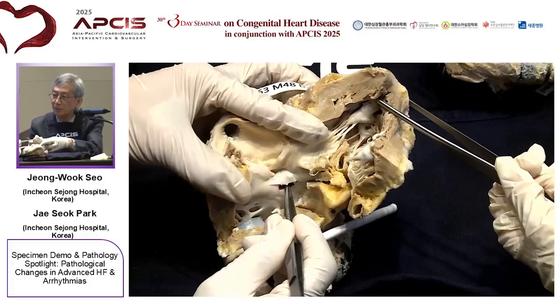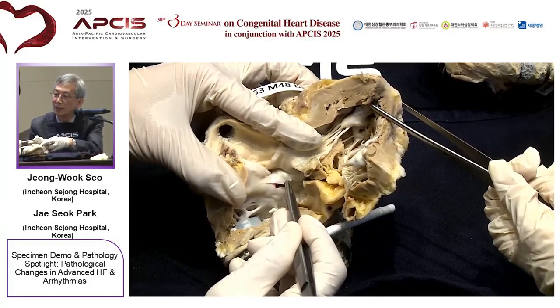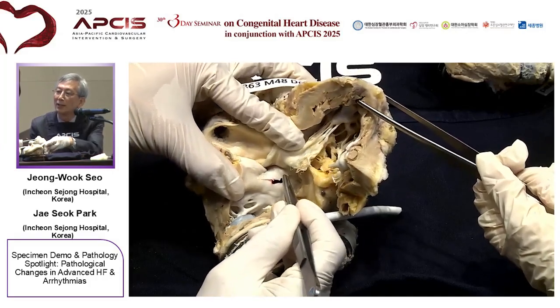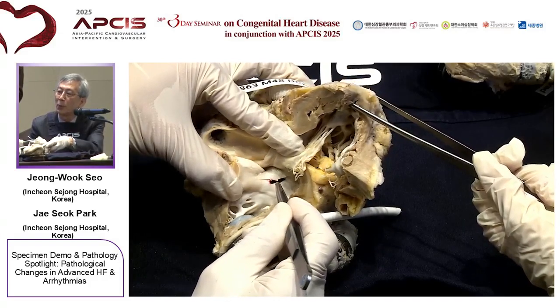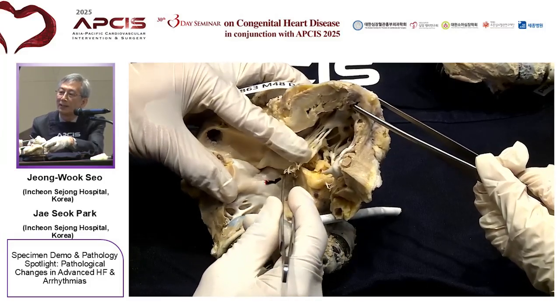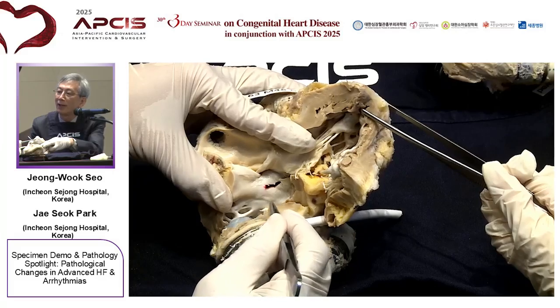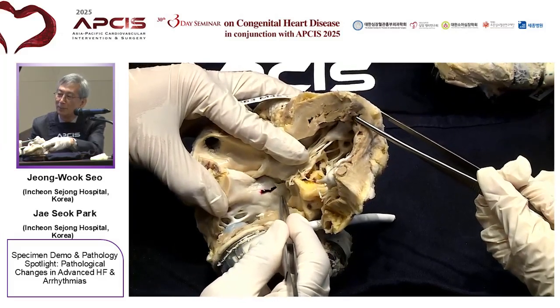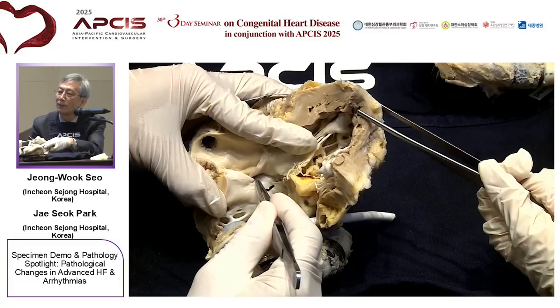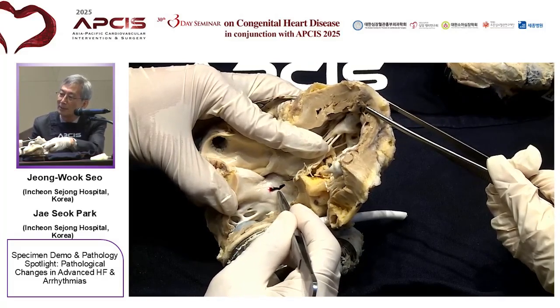But it was superficial, and this part is fibrotic, and the left bundle branch at this level was atrophied. So we discussed that we'd better try LBB area pacing more to the apical side, because it would be safer. And if possible, we could do some mapping of viable left bundle branch (LBB) tissue from the left side, to determine how far from the beginning of the LBB to the placement of LBB area pacing.